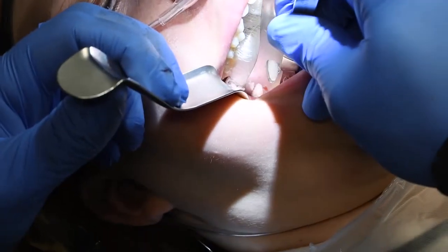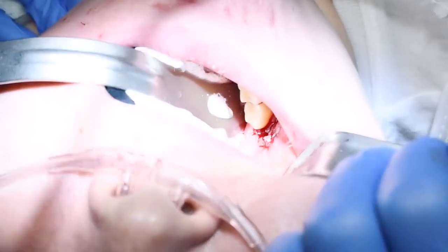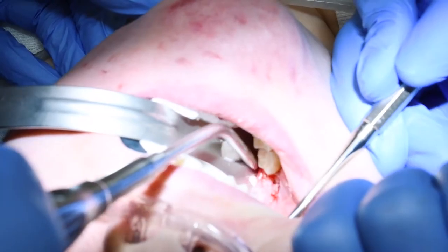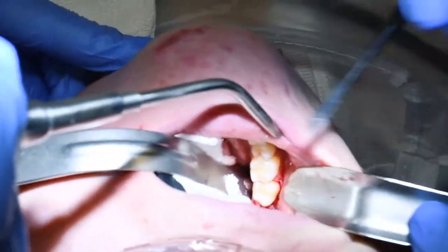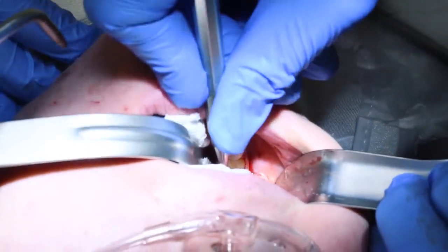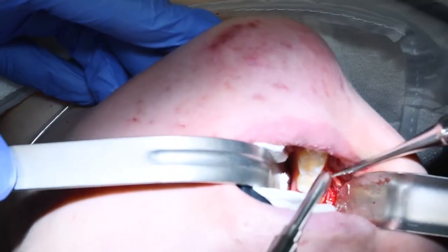This is called a buccal hockey stick incision — you can see how it comes out towards the cheek and comes around up to the front part of the second molar, also known as the mesial part. Then I need to make an incision on the top as well with the periosteal elevator, so we'll raise a flap on the top. There's that tooth — this tooth right here. It looks like I should be able to elevate it without having to cut on this side.